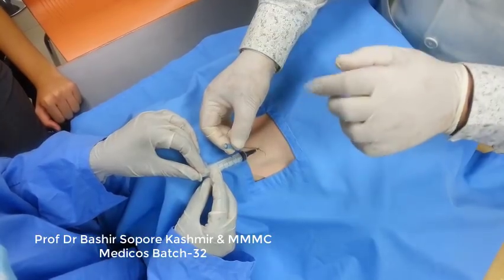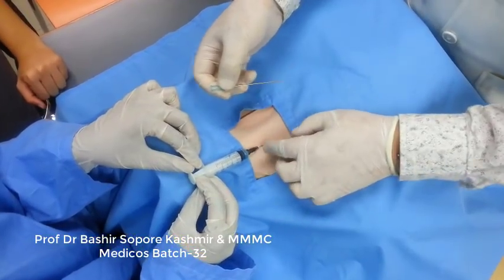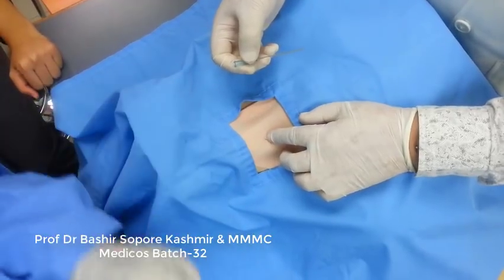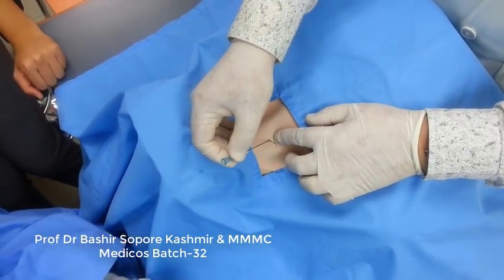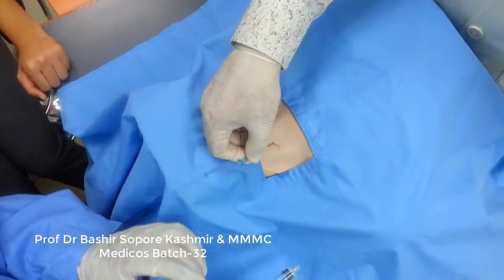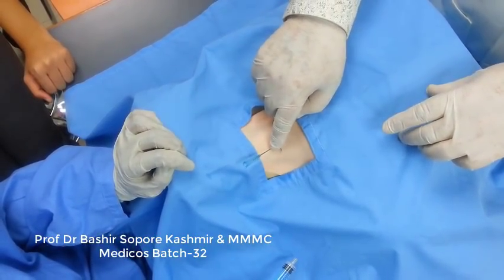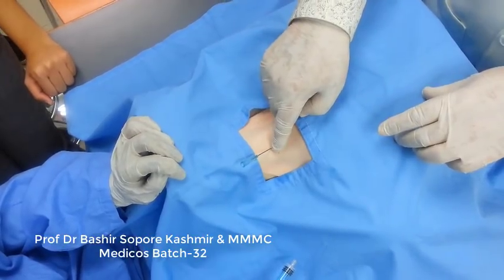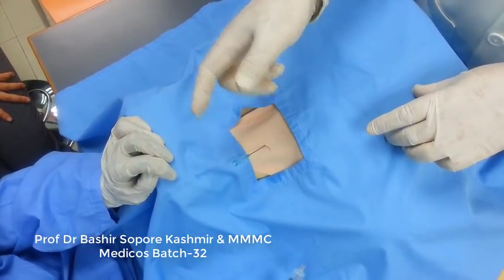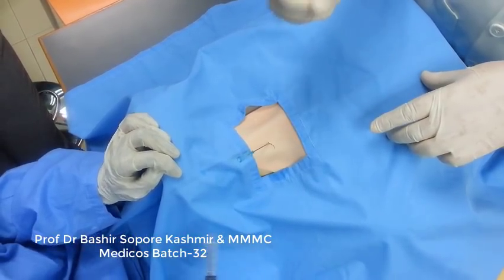Or, if you don't want to do it like this, then you can do it another way. You take the syringe out, everything out. There is a nick here, so through this nick only, keeping in mind how I had introduced the finder needle, you introduce the needle. So two methods are there: one is to insert this needle parallel to the finder needle, or you remove the finder needle and insert this needle through the same hole. That is the importance of the finder needle. That is why I am laying stress on the finder needle.